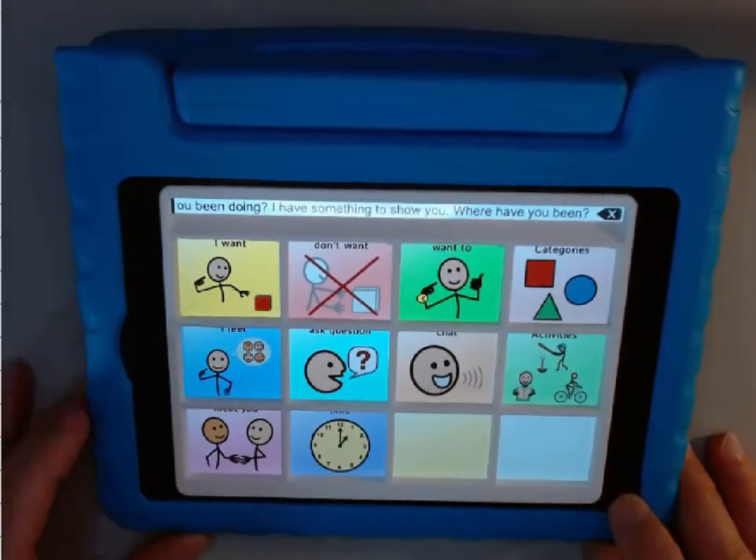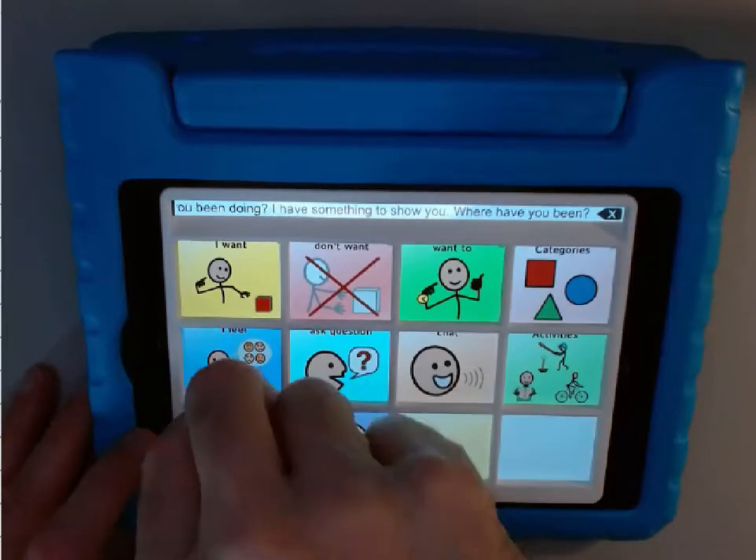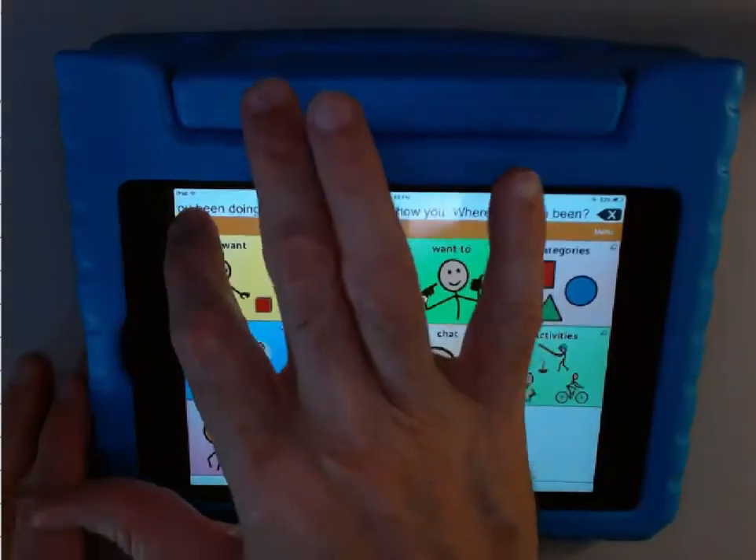But what if the child improves in their vocabulary use of the AAC device and needs more buttons? Well, we can just remove this keyguard and change the vocabulary.